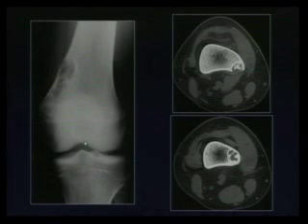Sometimes, like in this case, what is this? NOF. NOF, or fibrous cortical defect, or fibroxanthoma are the same lesion. Fibrous cortical defect is when it is less than 2 centimeters, some people use 3 centimeters. In this case, what you have is a cortical defect replaced by fibrous tissue. So you may see cortical discontinuity, and this does not mean that the lesion is aggressive, right? Here it is clear, you have an elongated lesion with sclerotic margins, so this is an NOF. But when you evaluate the CT, you may think that this is an aggressive lesion because there is cortical discontinuity.